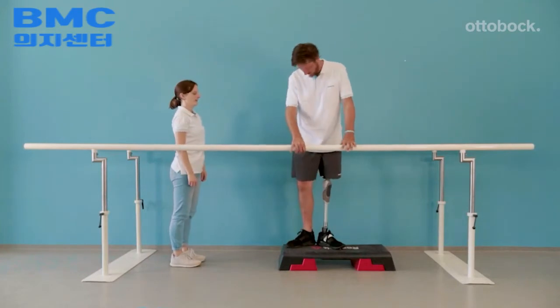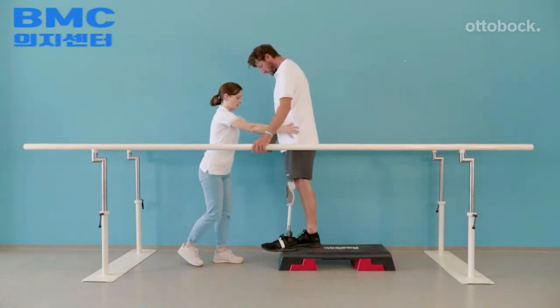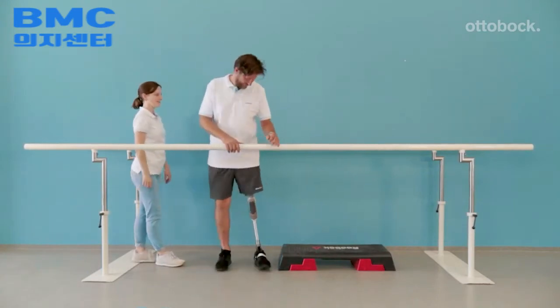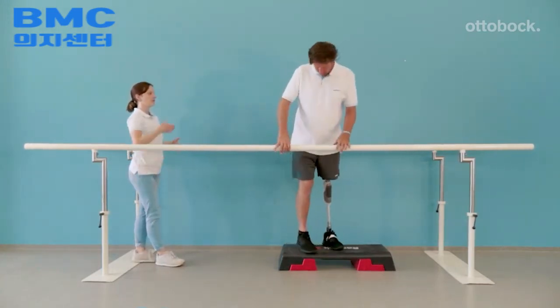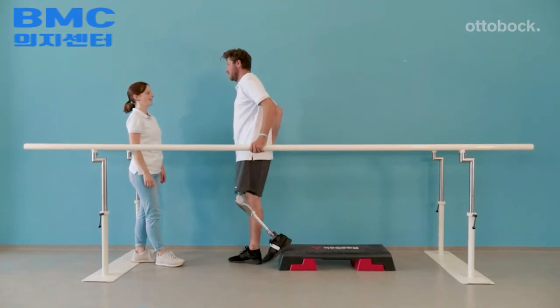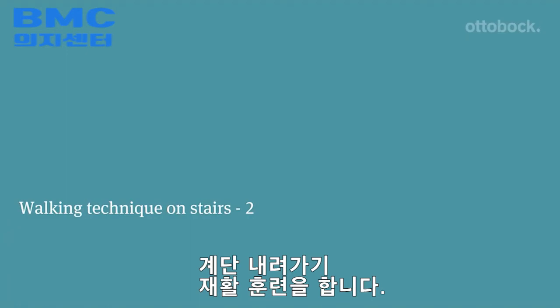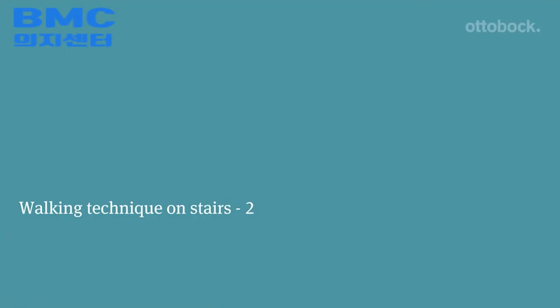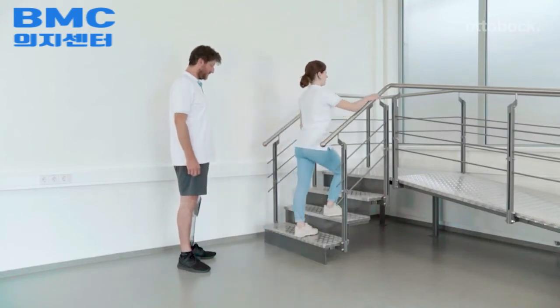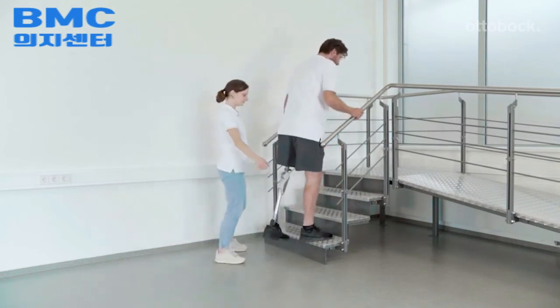With support at the pelvis, the therapist is able to initiate weight shift, control the direction of the movement, and correct deviations of the pelvis. A correct downstairs movement is made with an upright posture while the pelvis stays over the foot. Avoid residual limb extension.